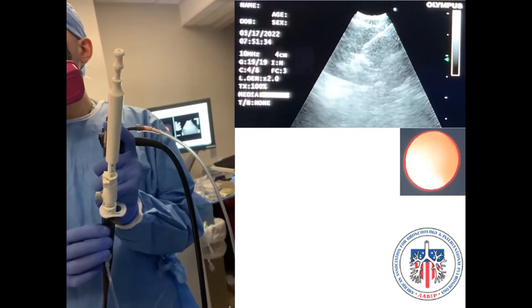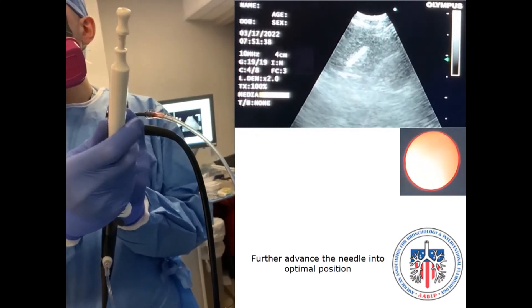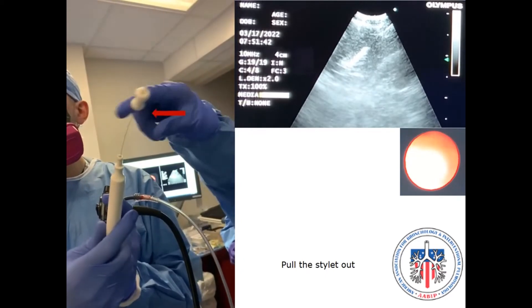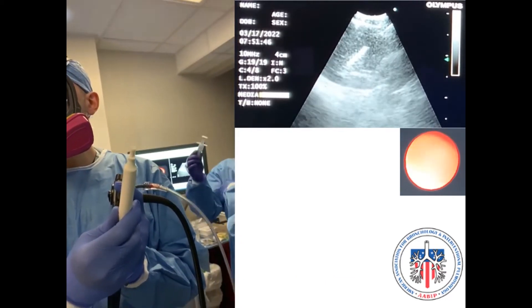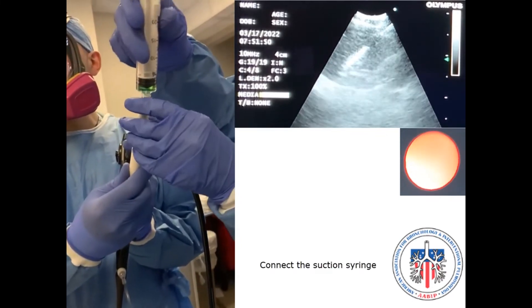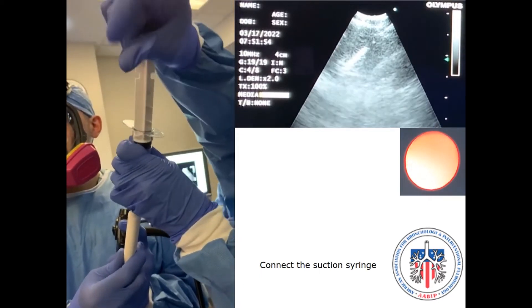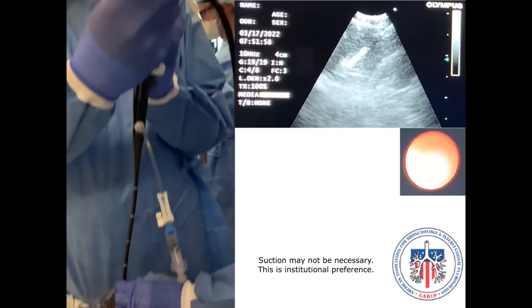Push the scope further down to ensure adequate apposition of the scope with the airway wall. Lower the needle lever down and advance the needle further into the lymph node. Pull the stylet out. Connect the suction syringe and apply suction. Next, you can start sampling the lymph node.